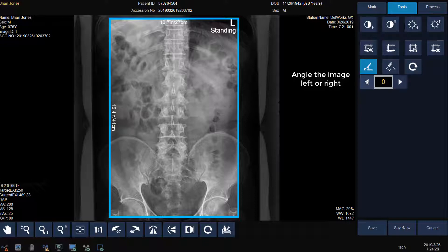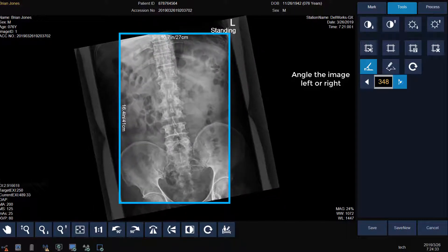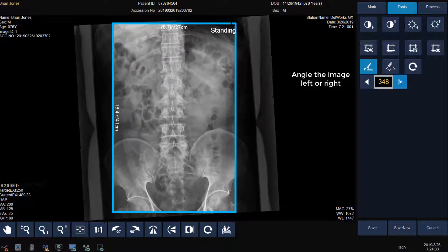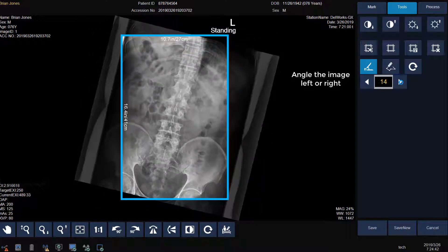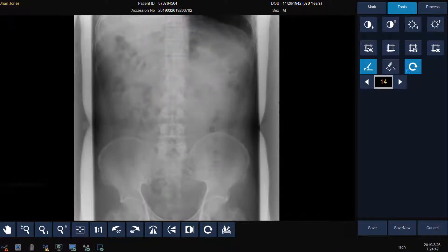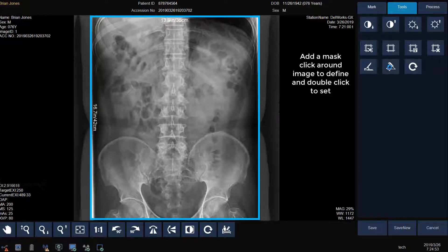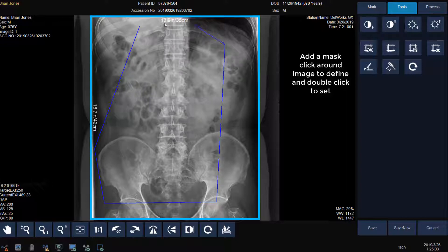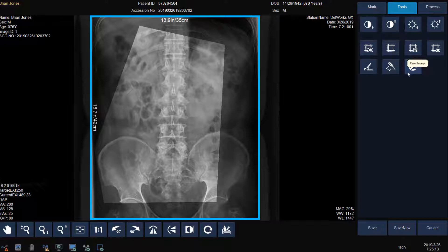We can also angle the image to the left or the right in increments, which could be useful if your body part has been taken at an angle on the detector and you want to display it vertically or horizontally. We can also add a mask around the image. To do so, click on the mask icon and then click as many times as you need around the desired area on the image, and double click where the two lines join to apply the mask. To remove the mask, click on the mask icon again.